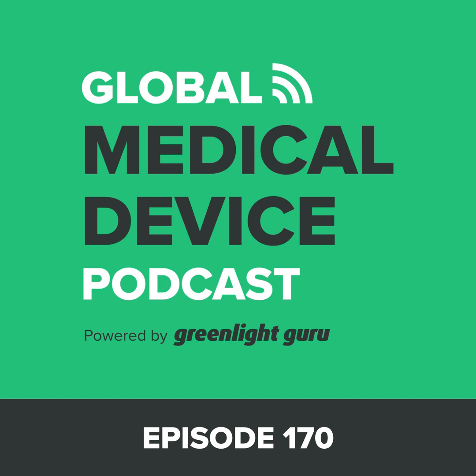It seems like, again, pre-sub is a means for me to try to communicate to FDA what I'm doing with this product. And it seems to me that a picture is important. So I think something like a software architecture diagram or something of that nature, it seems like that'd be invaluable as part of a pre-sub. What do you think? Absolutely. It's something that is listed in that guidance document as even separate from the device description. And we typically do put it into our device description section of the pre-sub, but I think it's listed separately because of how important it is.